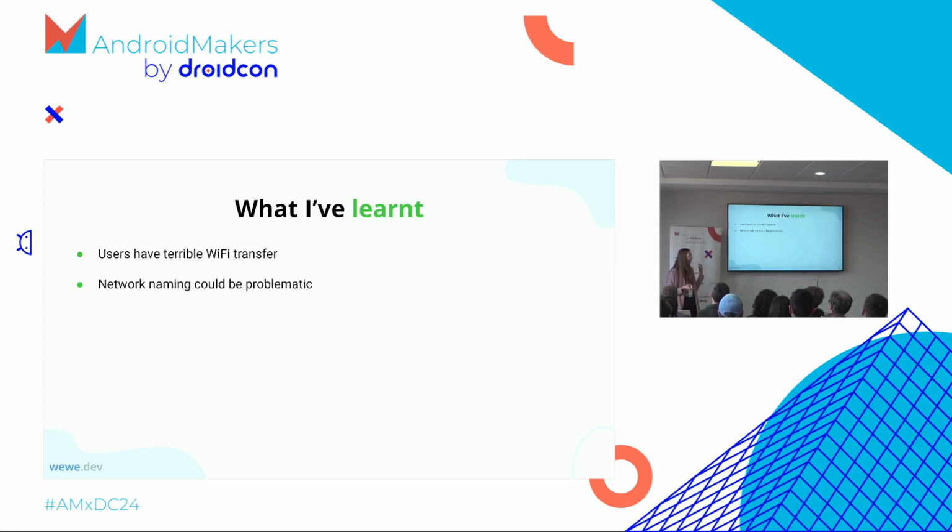But in our case, we couldn't assist the user to change the network because he wouldn't be able to choose that: "I would like to run on this network with this particular frequency." So in this case, we may only suggest just using mobile data transfer.